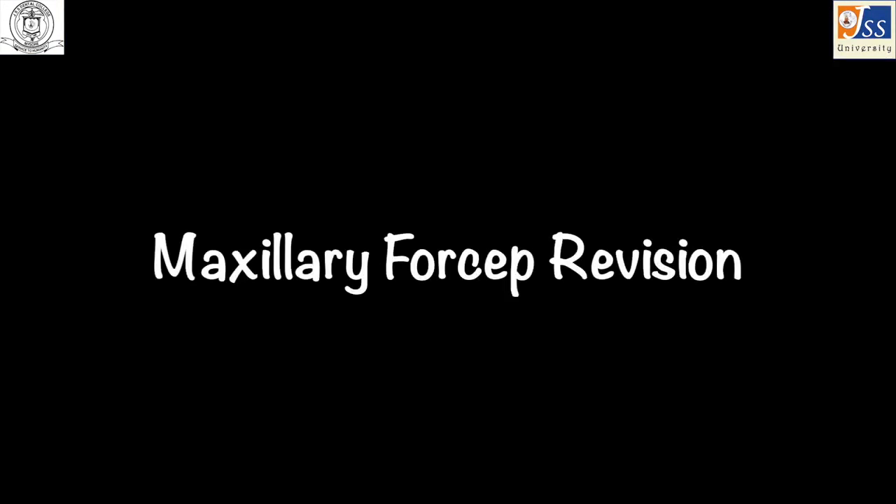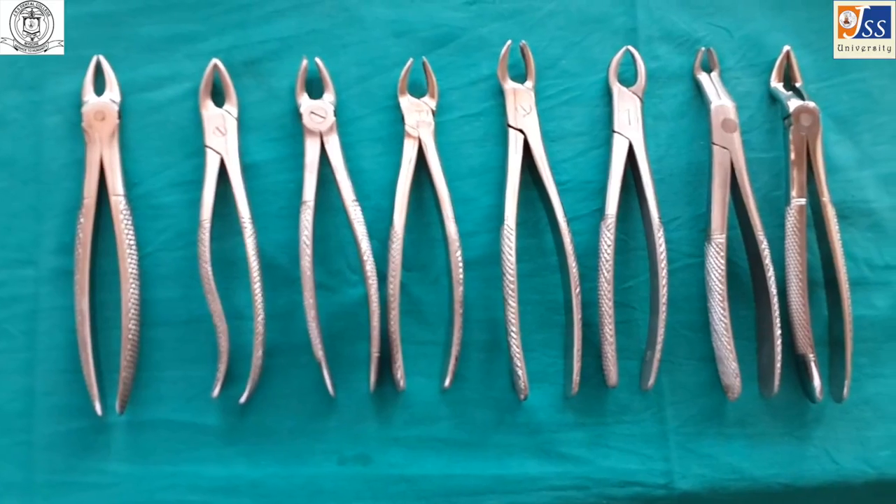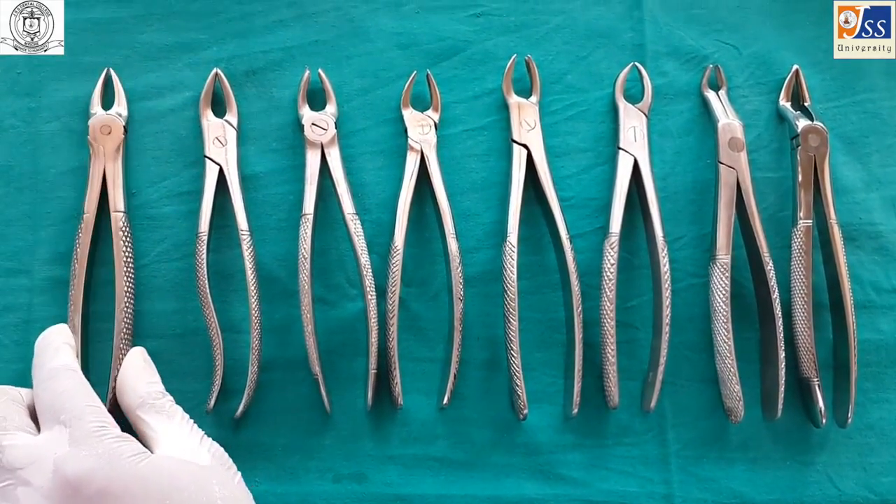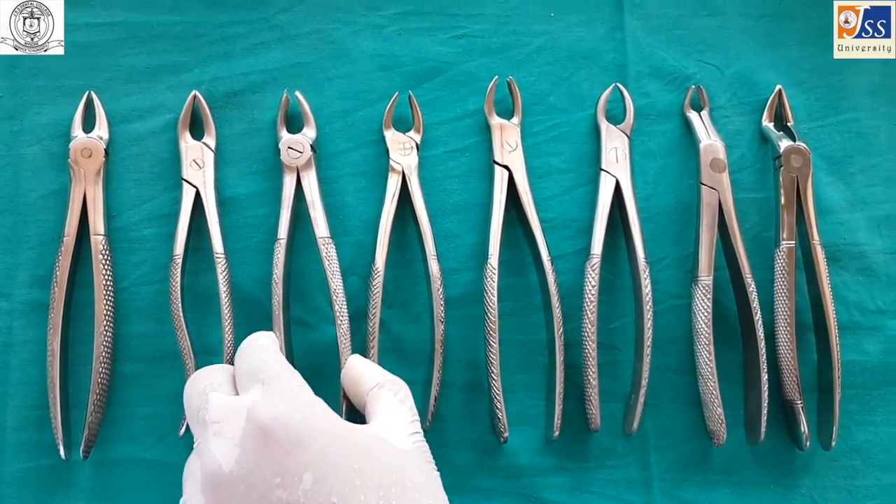Forceps revision — maxillary forceps: anterior forceps, premolar forceps, and molar forceps.